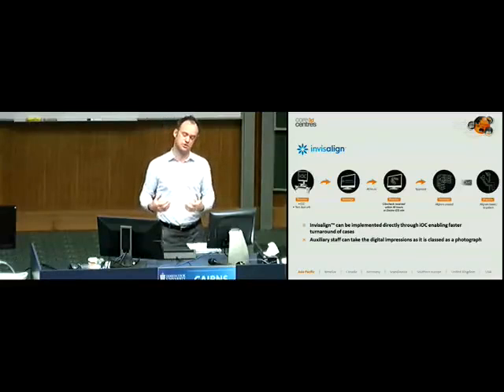The reason Invisalign like it so much is because one of the biggest roadblocks for doctors and orthodontists doing more cases is the impression. It needs a particular type of impression, and it needs to be a very consistent impression. And a lot of this time is spent by the practice development managers in not teaching people how to do impressions, that's probably the wrong word, but certainly re-familiarizing them with the specifications that Invisalign require, let's just say. So because that's a big roadblock, Invisalign looked to this technology to help them. So what can happen now is you can scan a full arch. It's a slightly different scanning sequence.